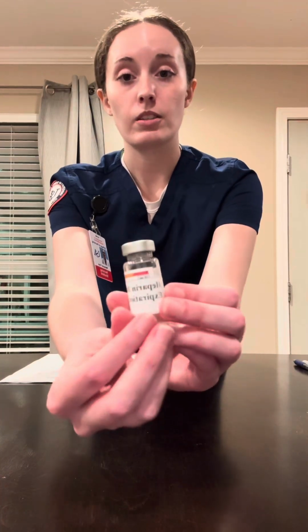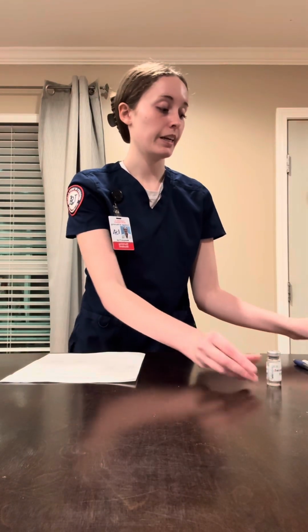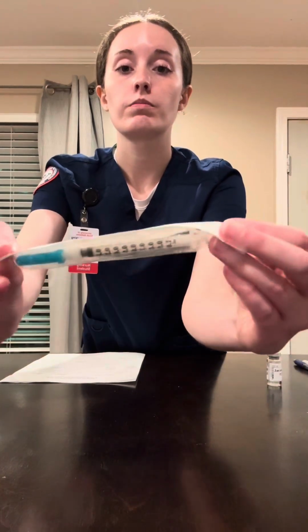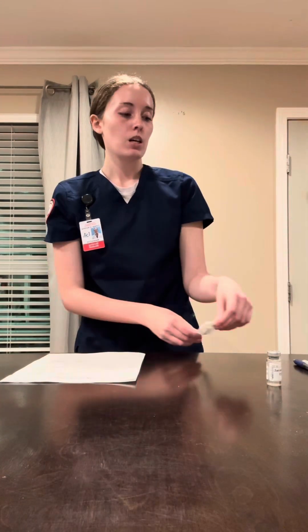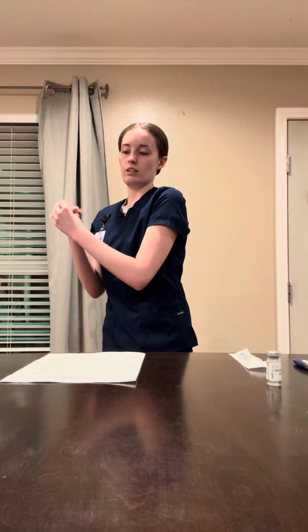So this is the vial of heparin. It's labeled correctly. Okay, and for a subcutaneous shot, I would be using a 1 milliliter tuberculin safety syringe. It is a 28 gauge and 1/2 inch. So here's the needle. Okay, so I'm just going to apply hand sanitizer again, just in case.